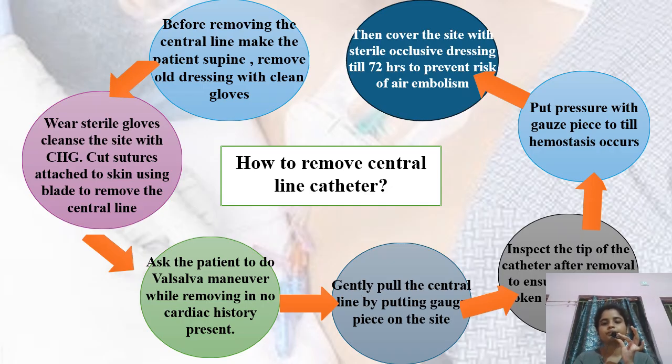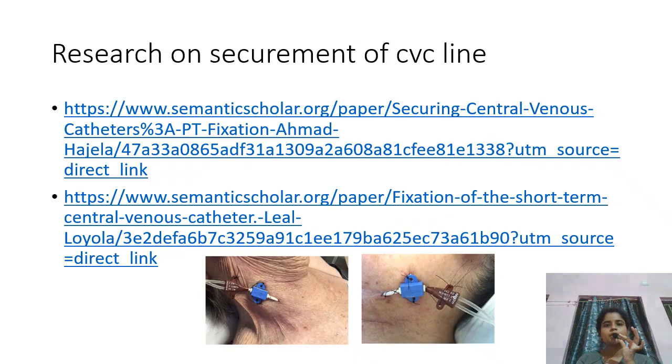Okay, so I hope you understood about the central line care, how to do it and how to remove the central line catheter. So these are some of the research papers which are there on the website about the securement of CVC line. There are different techniques for securing the CVC line.